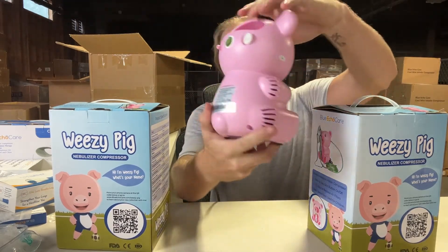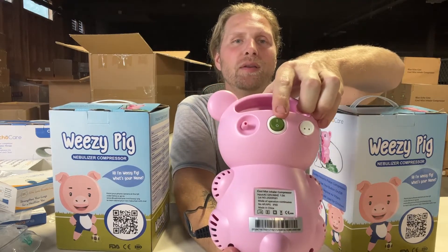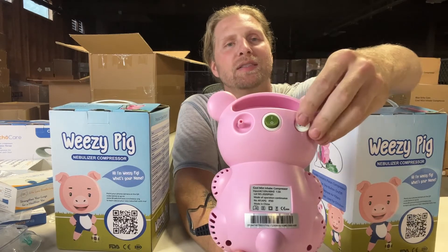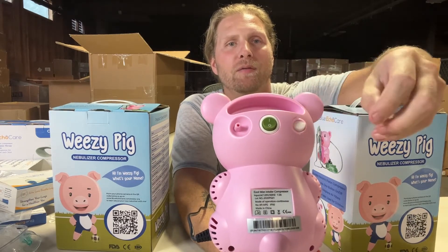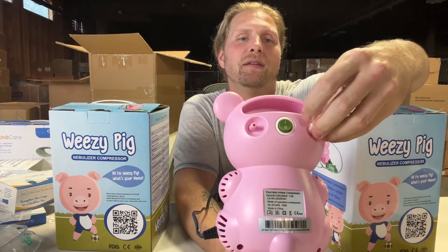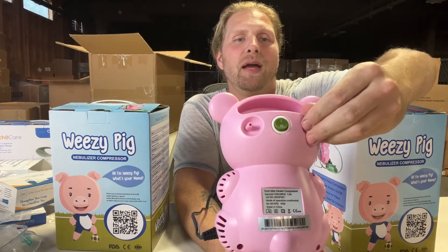It's a really easy process to do. Just turn the nebulizer around — you'll see the on-off button in the middle, and then on the left there's gonna be a little white disc shape right here. Simply open it up and you'll find the filter on the inside. Grab the filter, remove it, replace it with a brand new one, and then simply put the cap right back on.